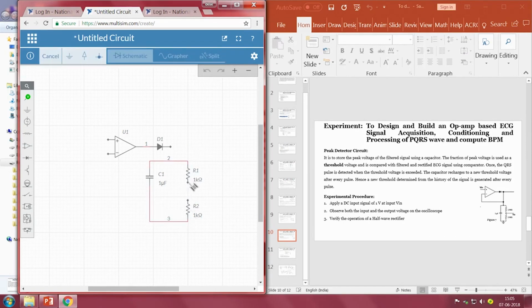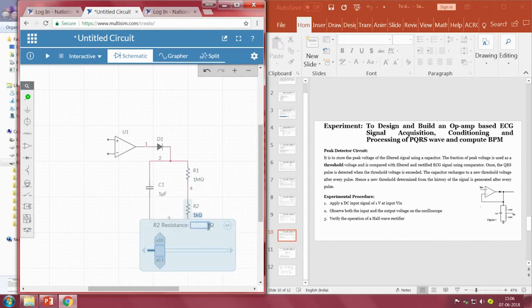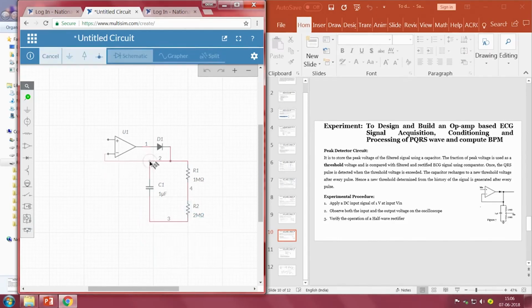Now, if you remember, the purpose of the capacitor is to charge to a peak value. So, whatever the ECG signal peak value is, that will be charged inside the capacitor. Now, the purpose of these resistors is to provide a threshold. We are setting a threshold using a 1 mega ohm resistor and a 2 mega ohm resistor. When we calculate, if we recall, it is somewhere around 66%, right. So, I am taking 1 mega as R1 resistor and 2 mega as R2 resistor. Now, we have to connect this terminal to this one, right. So, this is the input signal.